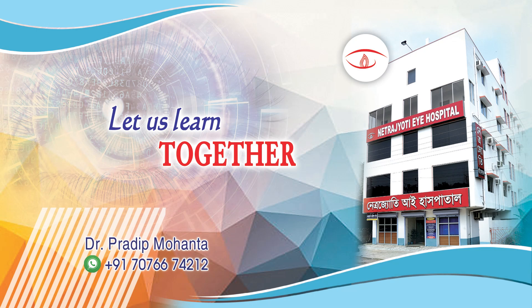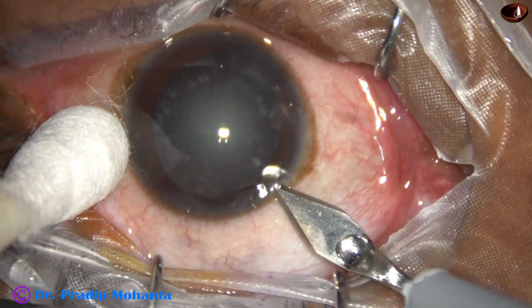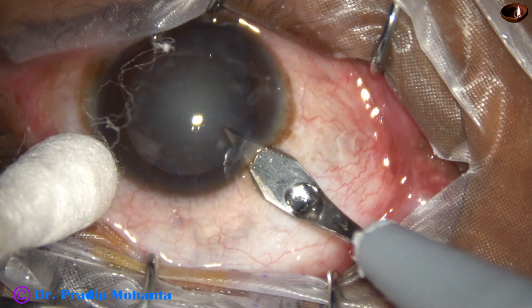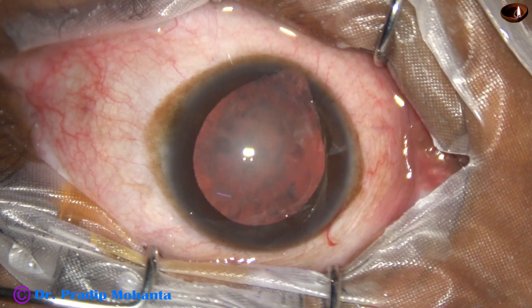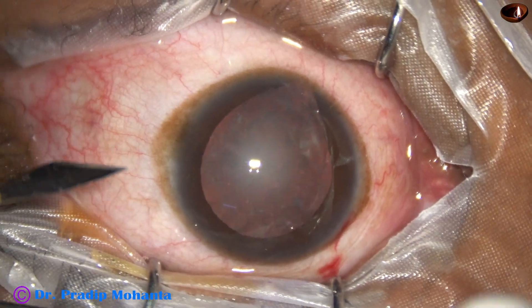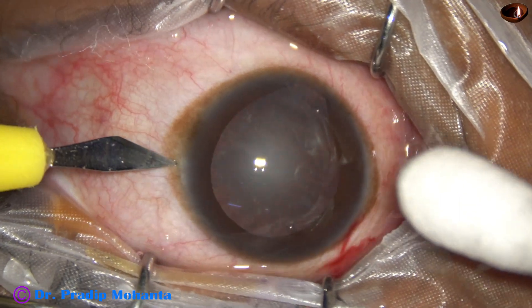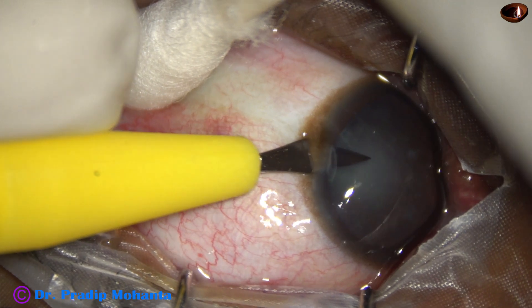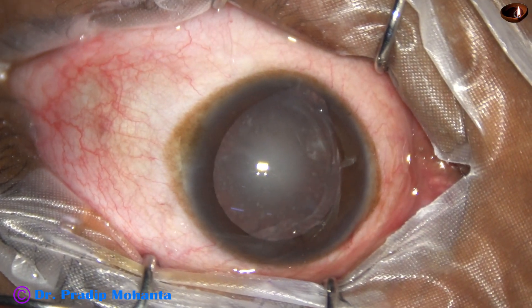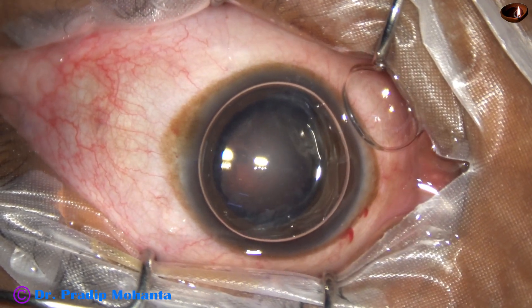Friends, let us observe this very interesting surgery. This is a cataract with coloboma iris. The patient is young, about 45 years old, a male patient. I have taken up this case for surgery. The main incision has been made, and now this is a sideport on the left side of the main incision, and now this is the air bubble.